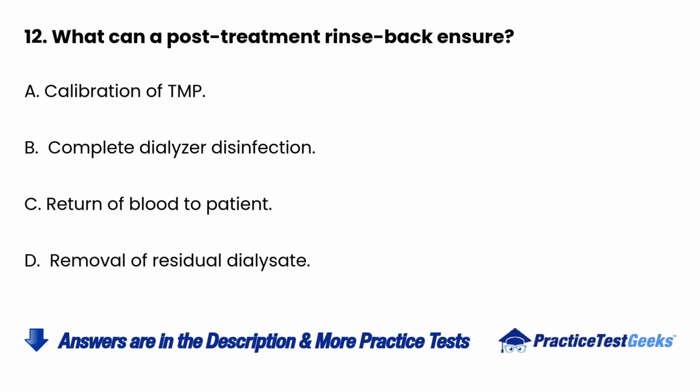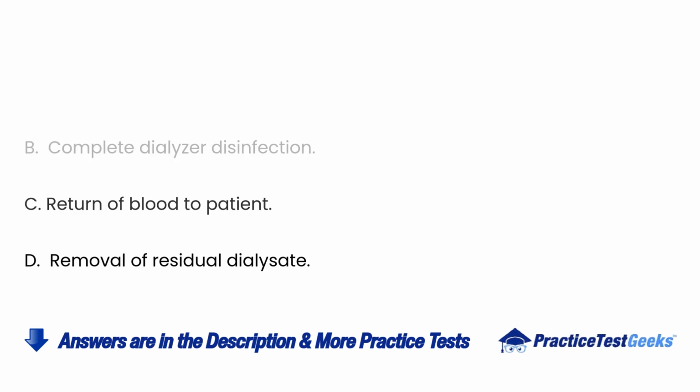12. What can a post-treatment rinse-back ensure? A. Calibration of TMP. B. Complete dialyzer disinfection. C. Return of blood to patient. D. Removal of residual dialysate.